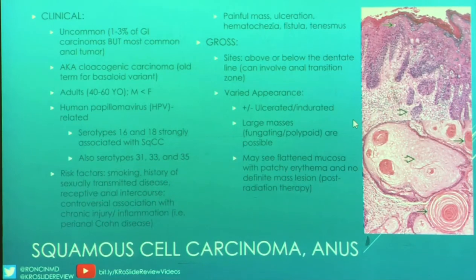In your pictures, it looks like the arrowhead on top is pointing to a lone coilocyte maybe, but you also have the invasion and that loss of maturation, well, reverse maturation really, with the open arrow on the bottom. And then the bottom picture is showing you some incredibly well-differentiated squamous cell carcinoma with those beautiful whirling keratin pearls. I don't think I've ever seen keratin pearls that nice in carcinoma, but that is beautiful.